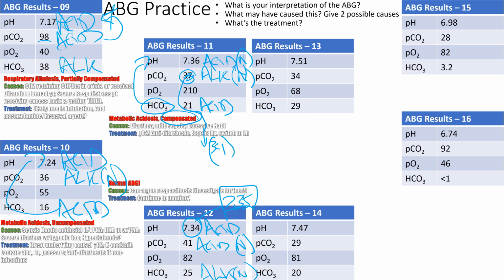Okay. So this is like a normal ABG, but I think I would change it to 7.35 if I really wanted you to say it's normal. All right, number 13, what is that? Definitely alkalosis. What's causing it? Well, bicarb is alkalotic. Is CO2 alkalotic?